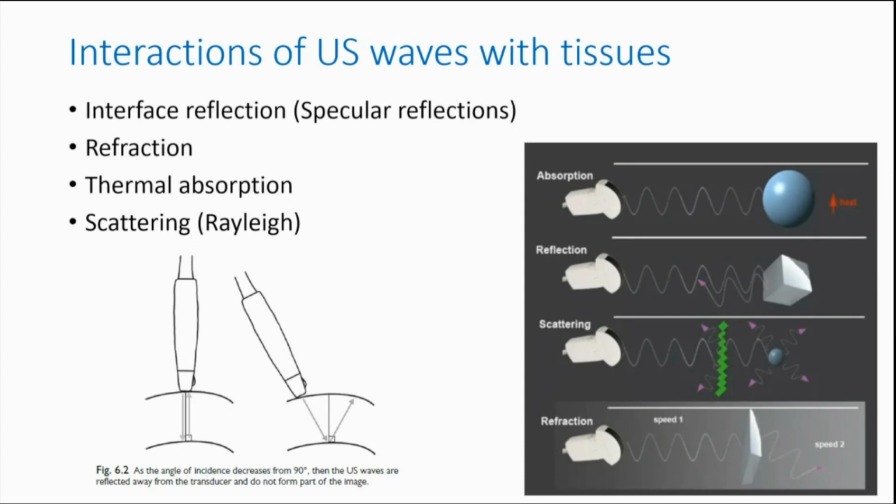As compared to, let's say, an anterior sciatic or an ultrasound-guided spinal, where you are going to depend more on tissue movement versus the needle itself. But of course, if you want to have a flat trajectory, you have to accept that sometimes you have to insert your needle a bit further away from the probe. That means you must have good 3D visualization, with a steady hand at the structure, and then distance yourself away and get the entry point at an ideal length so that the needle is relatively flat.